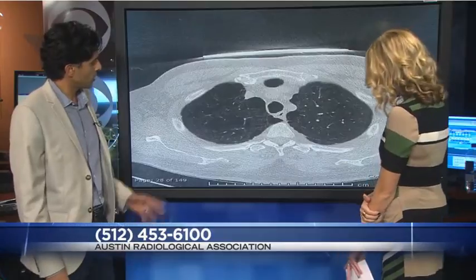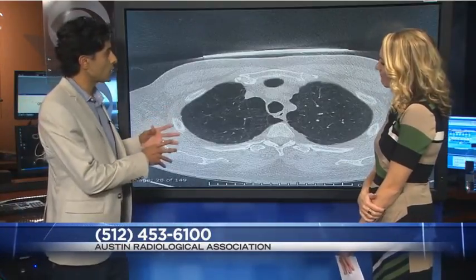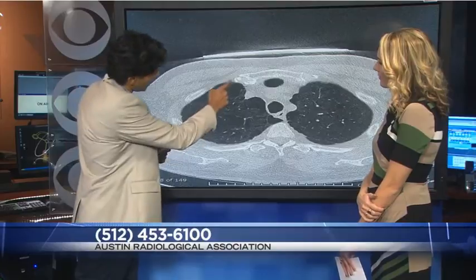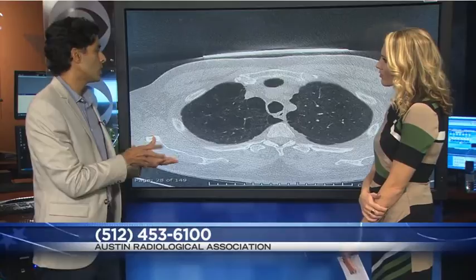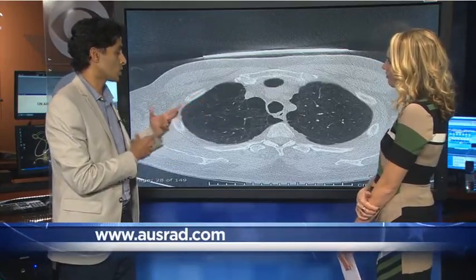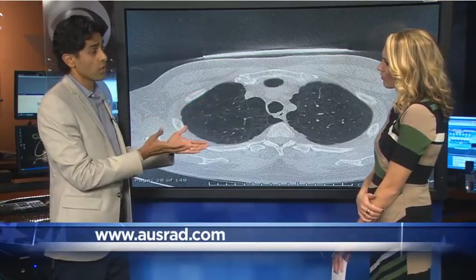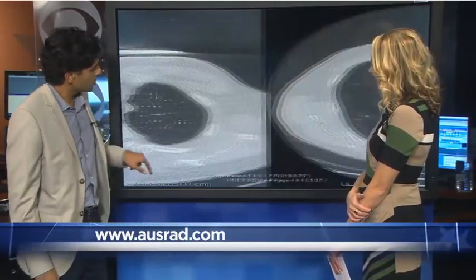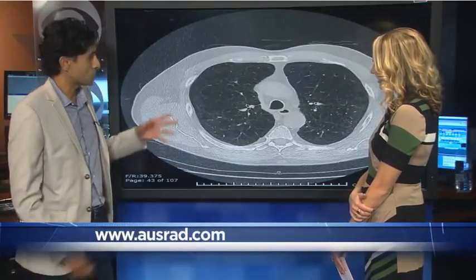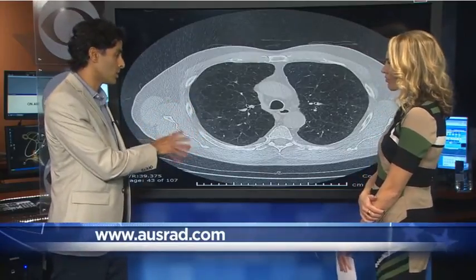These are the lungs of a patient with emphysema. What you may notice are these black spaces, like right here. Fairly mild emphysema in this patient. The black space represents destruction of normal lung tissue, which is caused by, what do you think? Smoking. You got it. The next image is that of a patient with severe emphysema. What's evident here is that there's an increased number and size of these dark spaces. That again represents increased lung destruction caused by smoking.